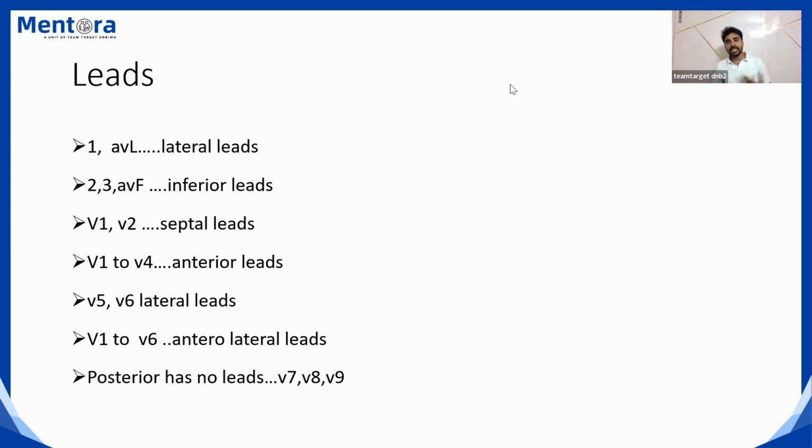If you take any ECG book, they will mention the limb leads, how you connect AVL, so much direction and axis they will put. It's very difficult to remember, I know. But for the practical course, you have to know only this slide. If you know this slide, you can read the ECG. If there is any problem in these leads, that part of your left ventricle is involved.